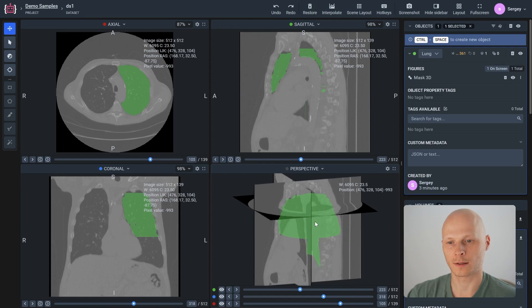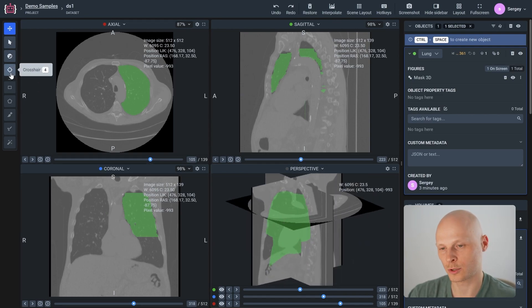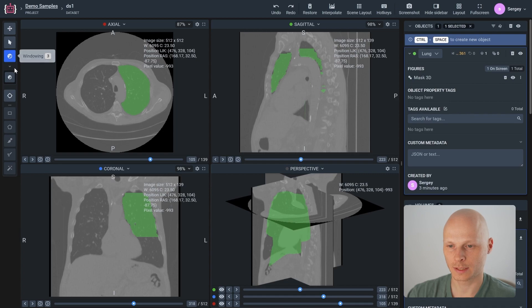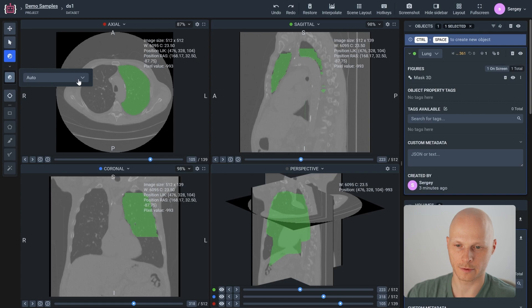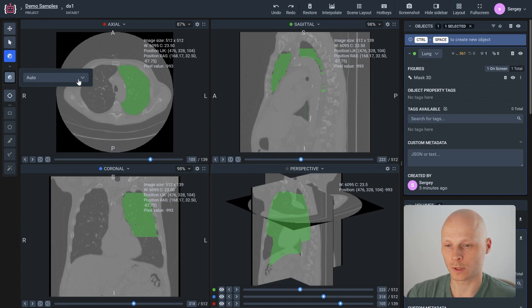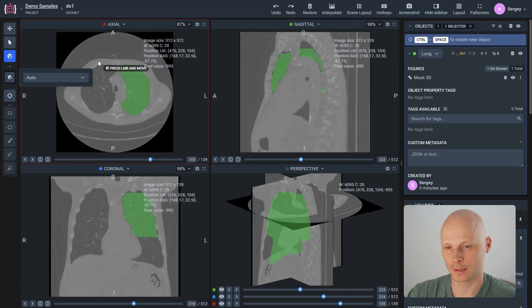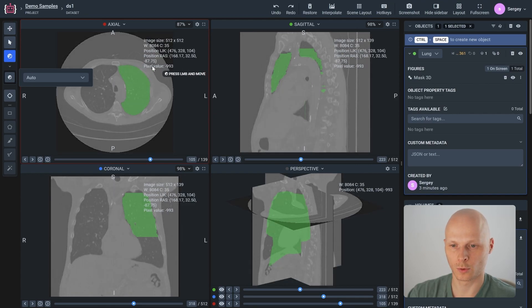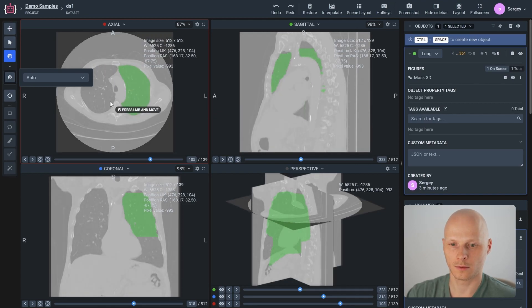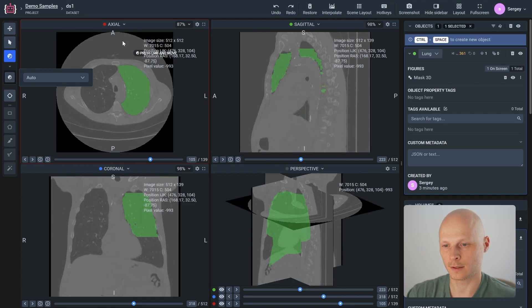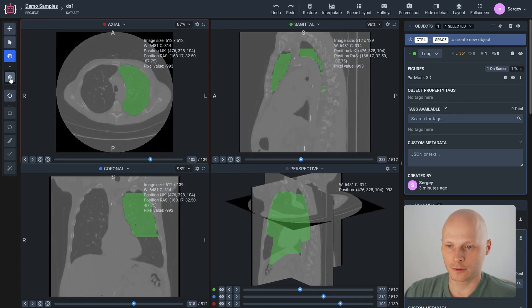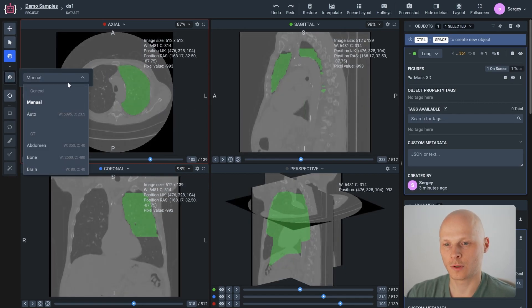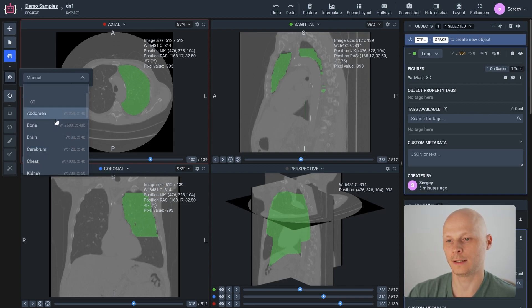Also, because we work directly with DICOM files, we have a windowing option. Right now, the colors we see on this volume are calculated automatically and limited to 256 layers of gray. But you can manually adjust contrast and brightness similar to what you can do in 3D Slicer or MITK. Alternatively, you can choose one of the predefined templates for windowing such as highlighting bones.